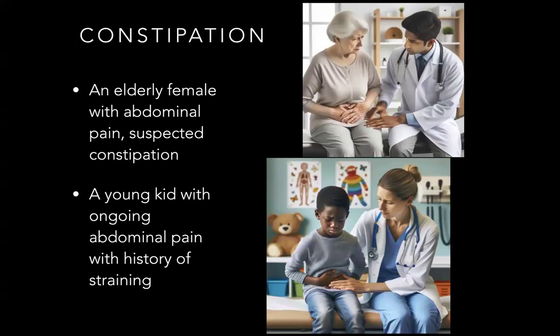Another really high yield exam in the primary care setting, and also in the same view as when you're looking for the bladder and the prostate, is looking for a big stool ball in constipation. How often do you see patients in the primary care setting where they're constipated, or you think that they're constipated, and they're either elderly, adults, or pediatric patients, whether they're constipated because of opioid medication use or dietary reasons or other things?